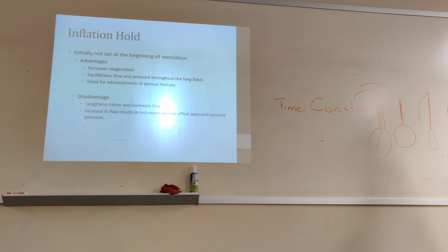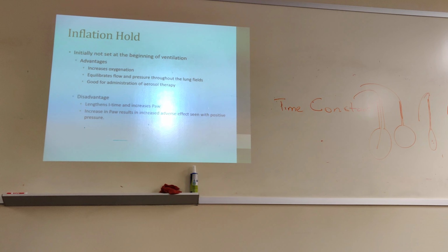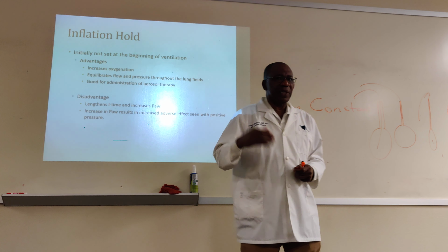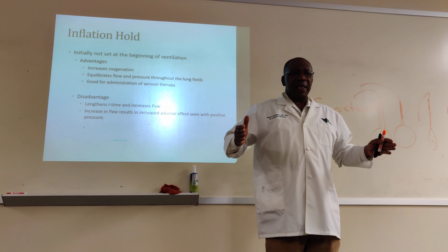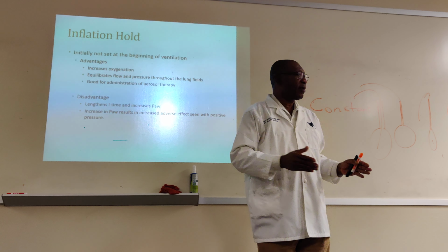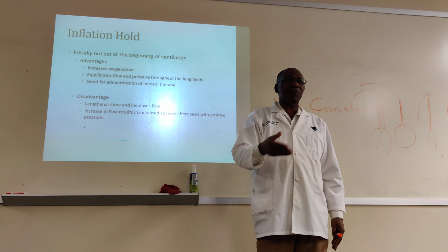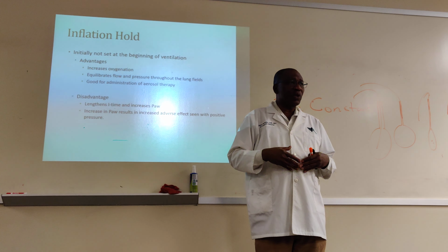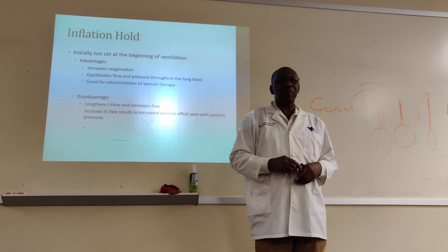So that's what we're saying here: if you add plateau time, that's another name for it, plateau time or inflation hold time or pause time, then you hold the alveoli like that. It gives you more time for the pressure to equilibrate throughout the lung field. That's why when we're giving patients breathing treatment, we tell them to hold their breath. We want the pressure to equilibrate throughout the lung field so that every one of them will be popped open.